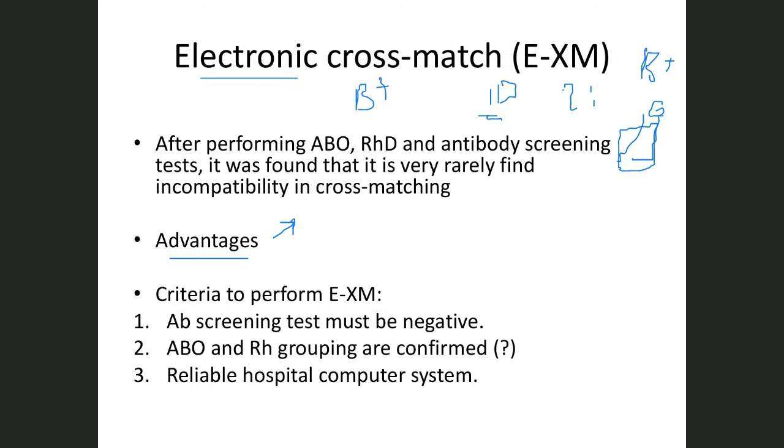So it has some advantages. Excellent: on the staff, there is no contamination. I will protect them because they will not be working with biological samples. So there are some advantages for electronic cross match.